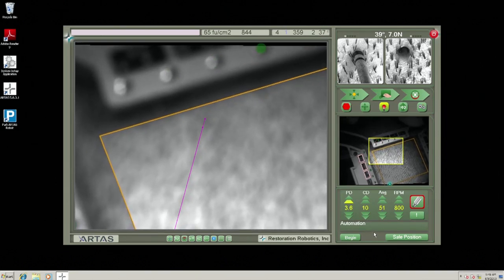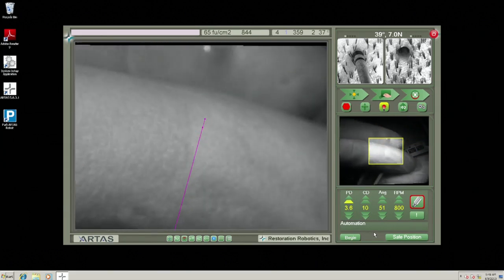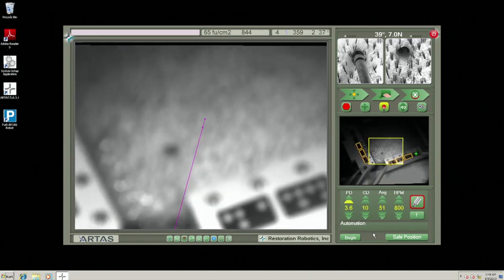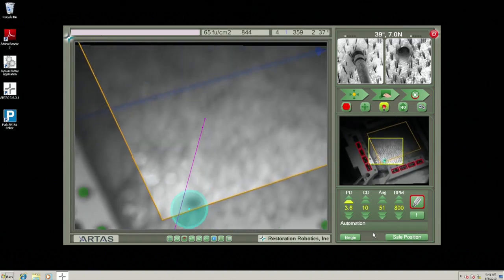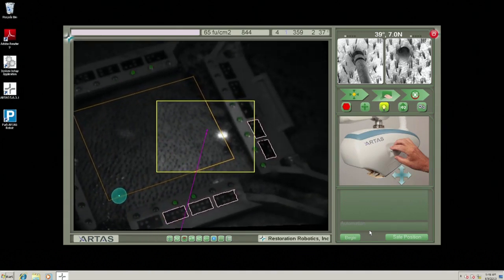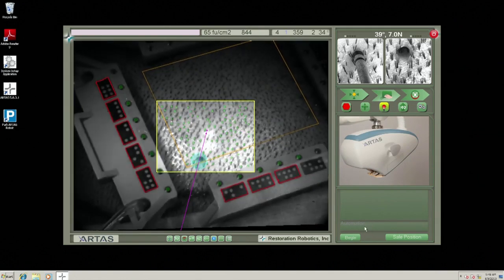We had a question from James. He says he didn't see you change any of the settings, PD, CD, angle, or RPM at the beginning of the case. He's asking, did you set it up beforehand, or is it set to defaults? How did the number come up for this particular patient?